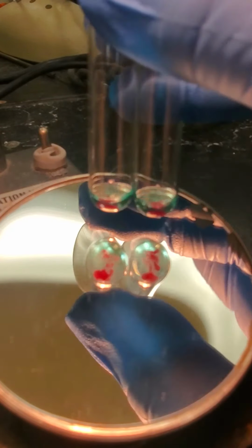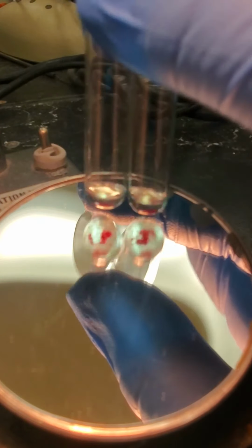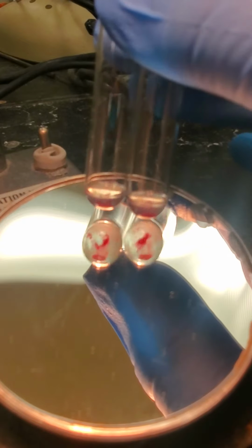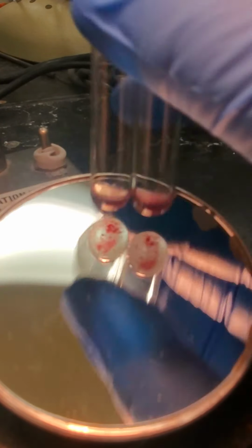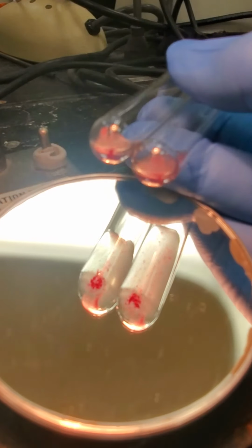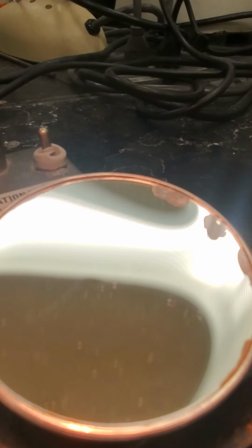Okay, I'm going to read these both at the same time. This is tube 6 and tube 13. So as you can see, those are positive reactions. So that's what we want to see.